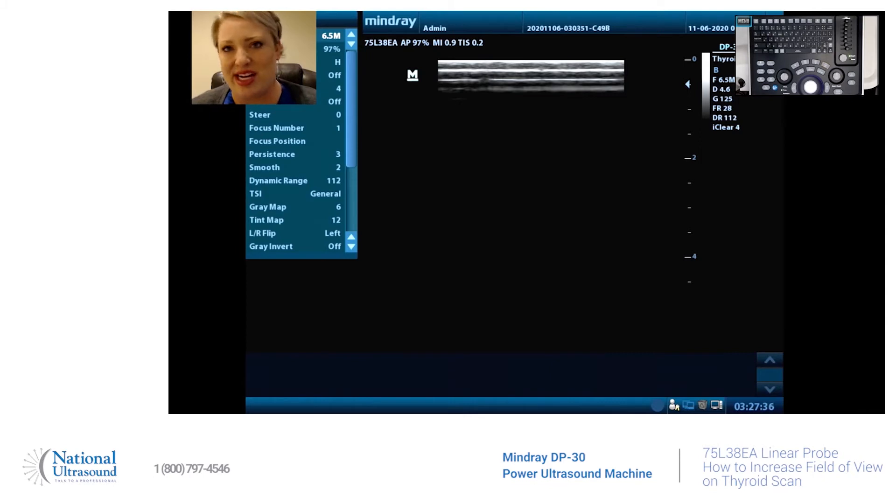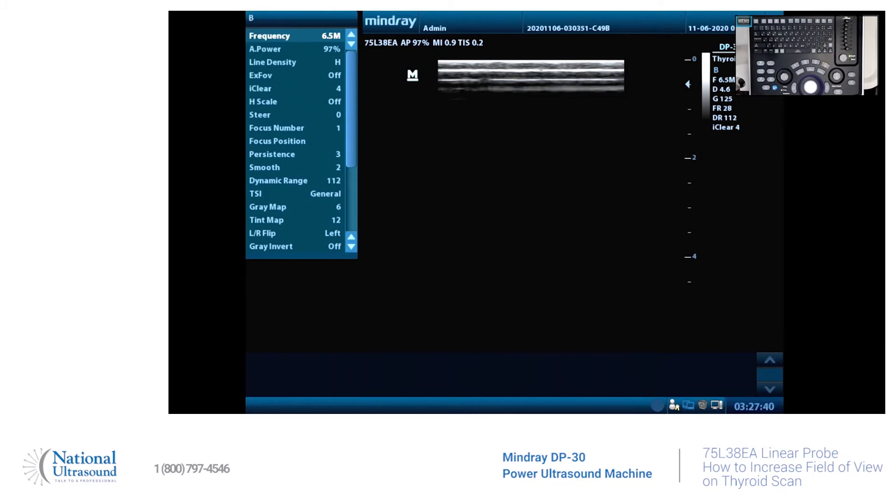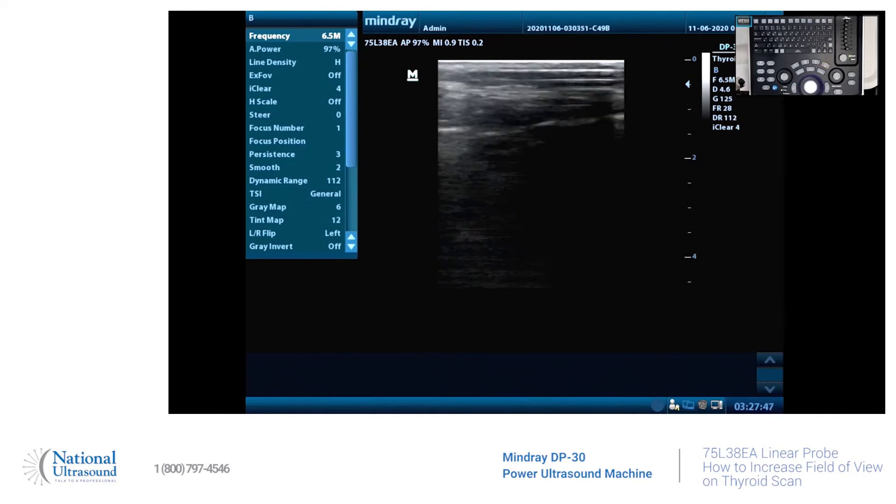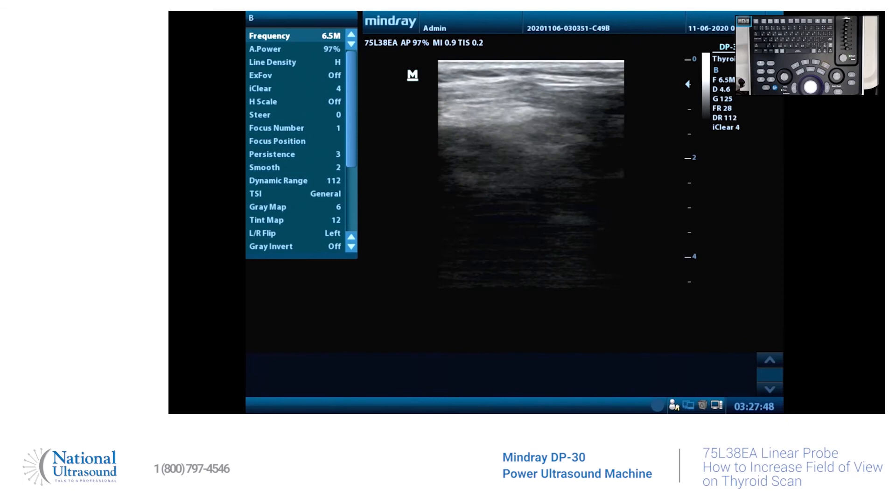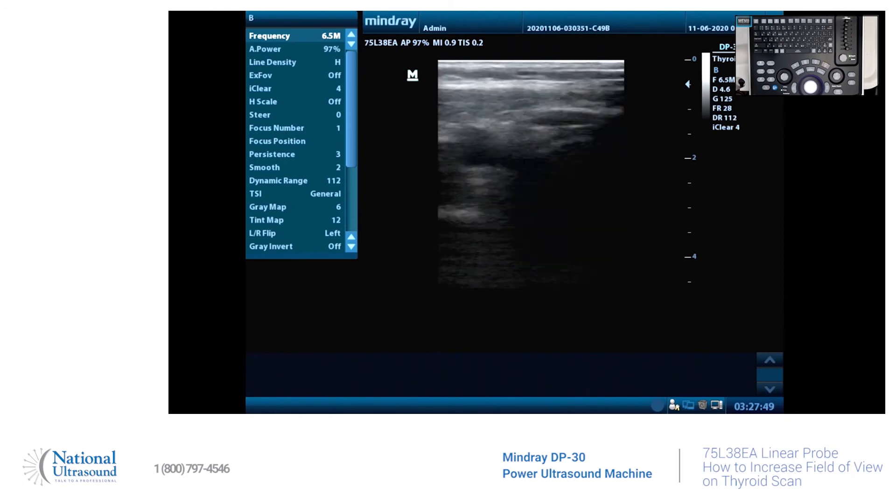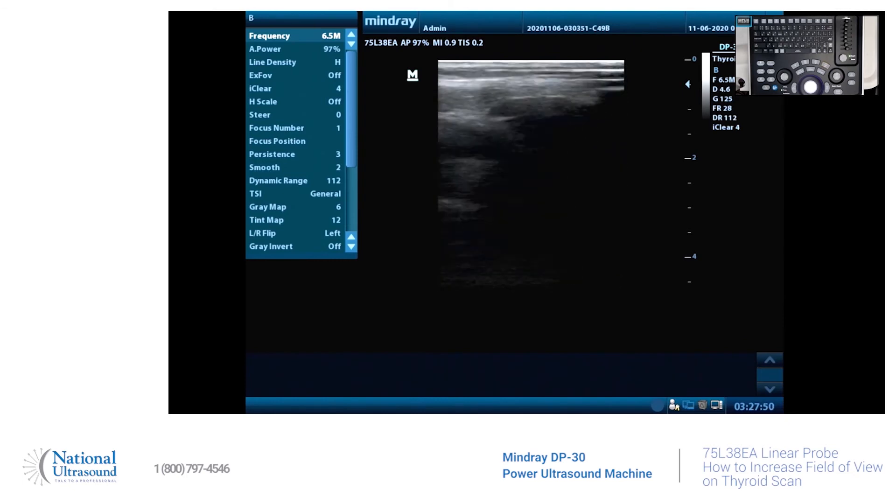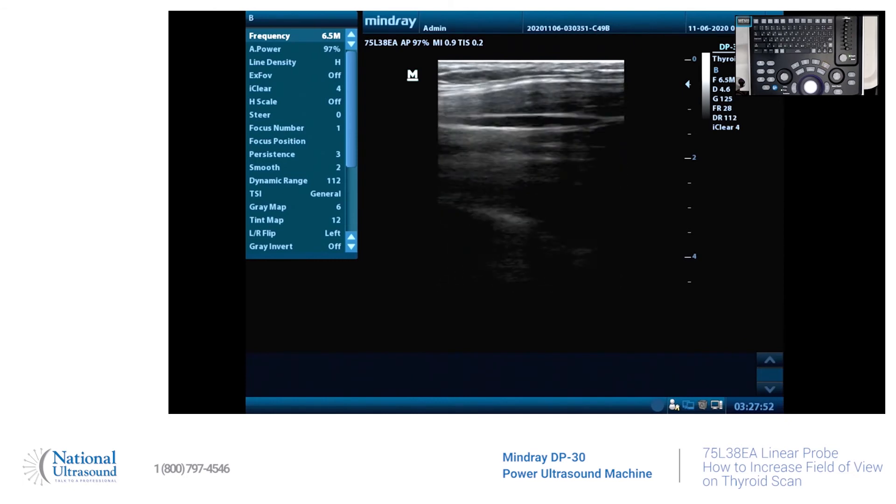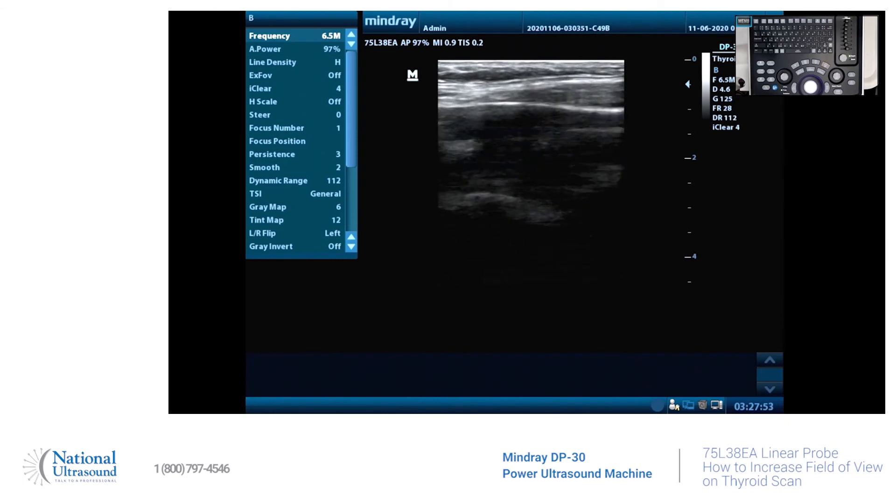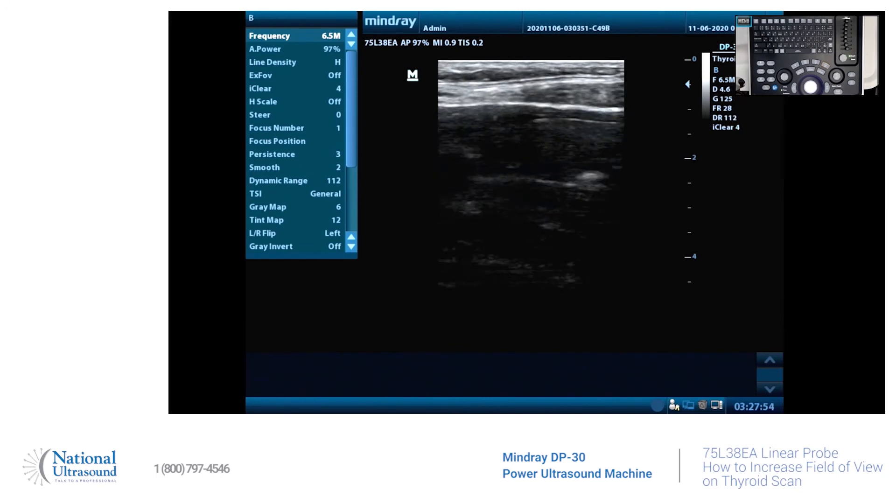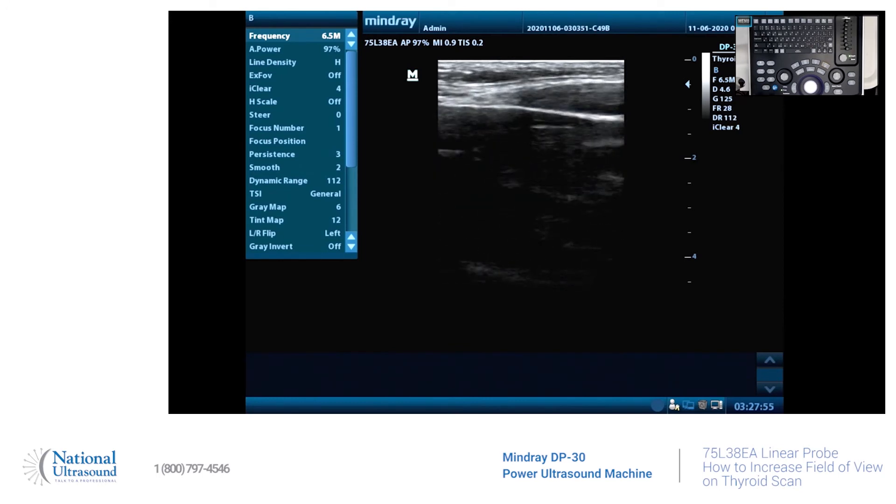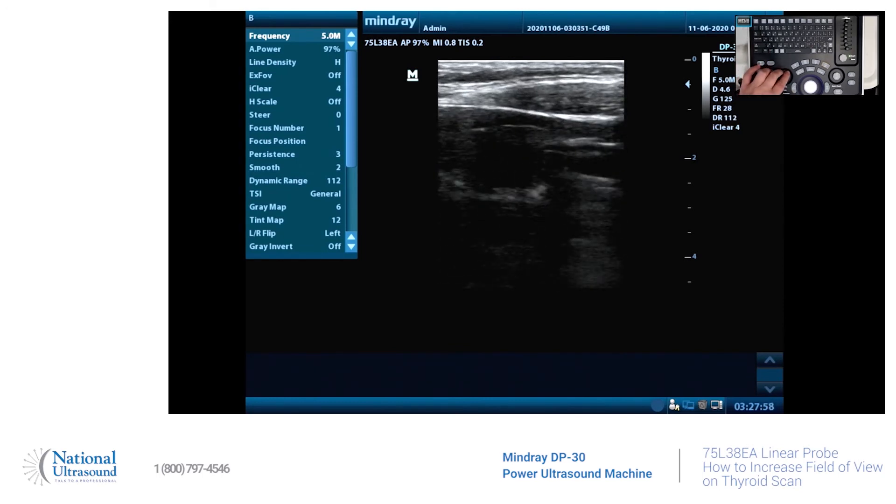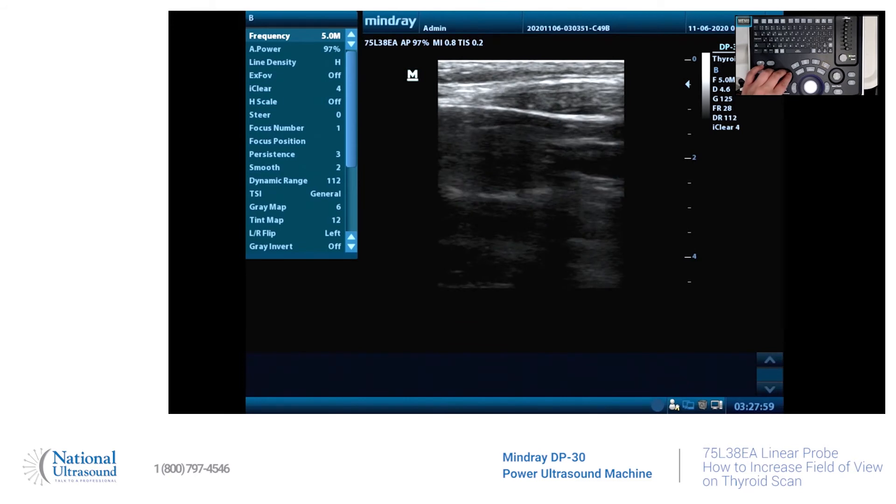Okay, first off, find that thyroid. Let me change the frequency.